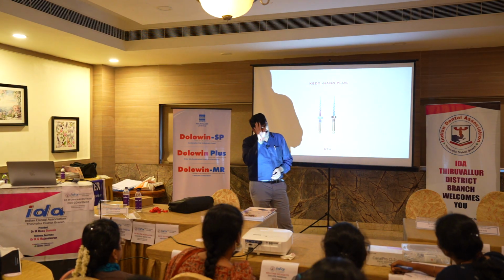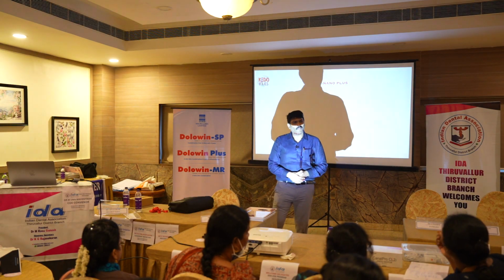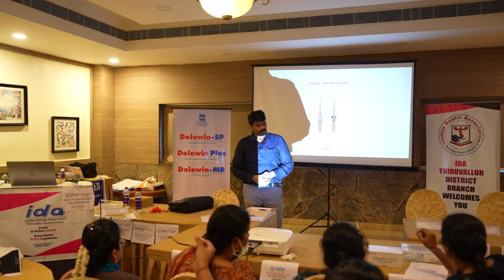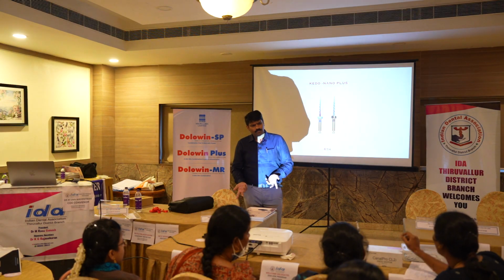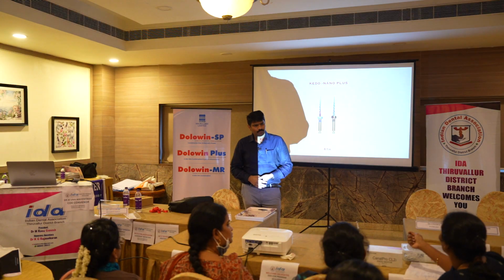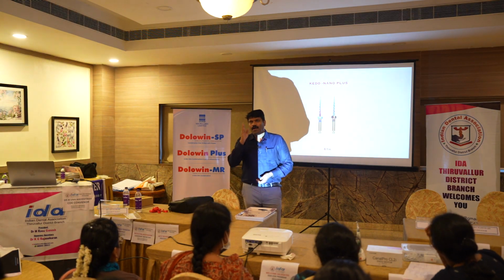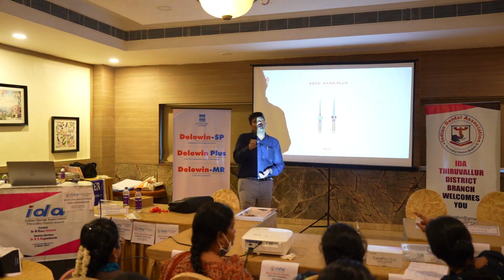If you feel the 15 is very loose, then use the 20. Use the hand file and apex locator, and there it will read.